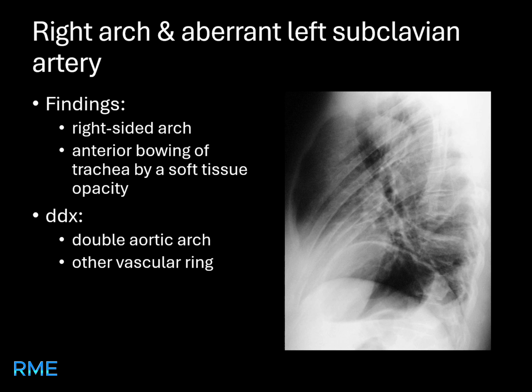To further evaluate, I would recommend a CT angiography or MRI to provide detailed vascular mapping. Management may involve surgical correction if symptomatic, especially if there are respiratory or swallowing difficulties. Let's move to the next case.